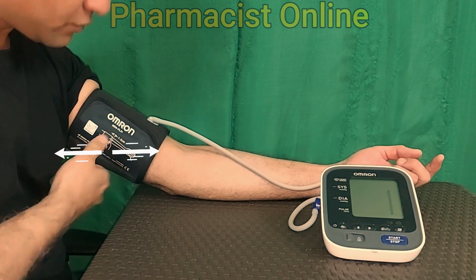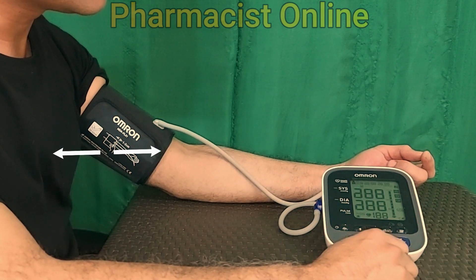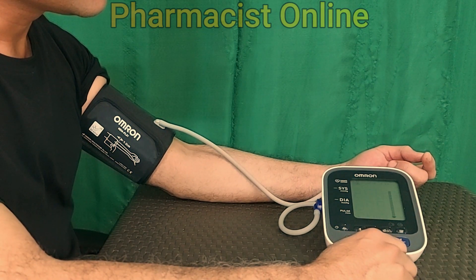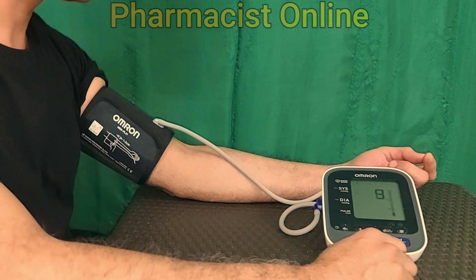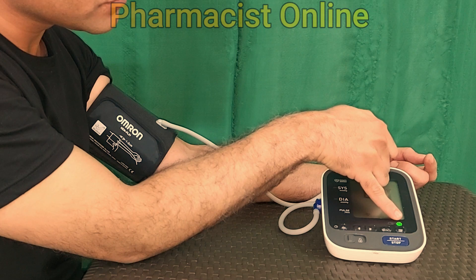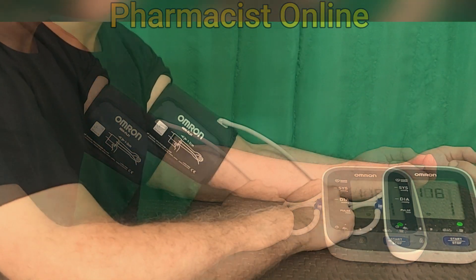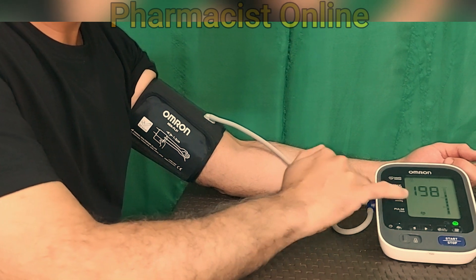The most important thing is to keep the arm cuff aligned to the heart position. Now press the start button of the BP machine and the device will start measuring blood pressure. You will get readings of systolic, diastolic, and mmHg.